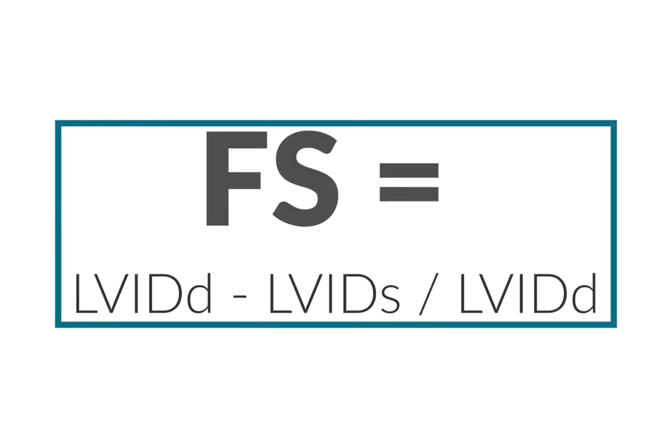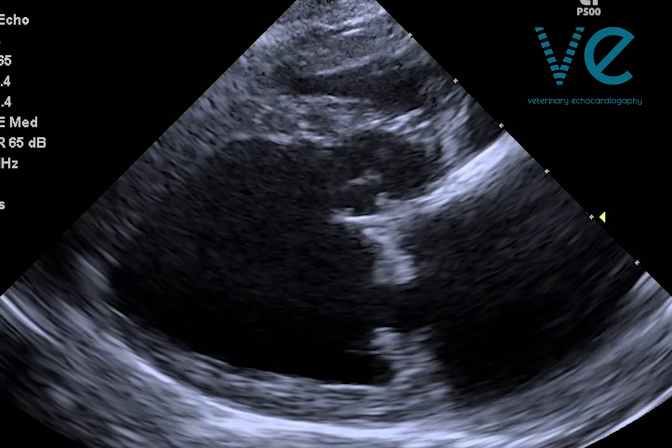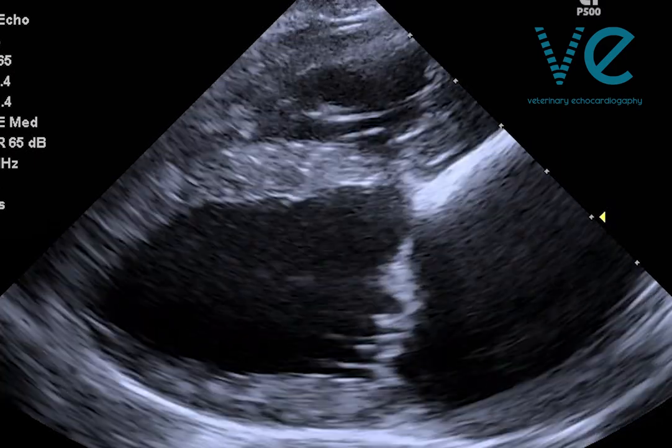Fractional shortening is simply the size change of the left ventricle between diastole and systole along a single linear plane. Fractional shortening over 25% is considered normal, but how likely is it that this patient — who has severe long-standing mitral valve disease and a dilated left ventricle — actually has normal left ventricular systolic function? This left ventricle is having to work extra hard to deal with this exceptionally large volume of blood.